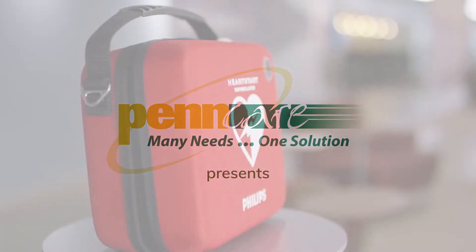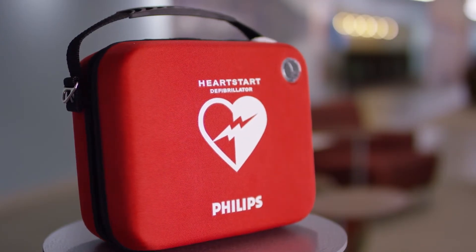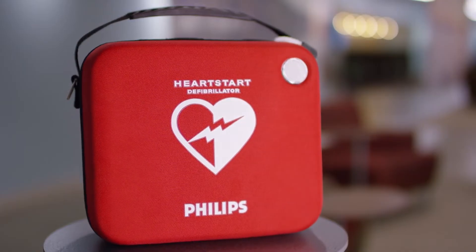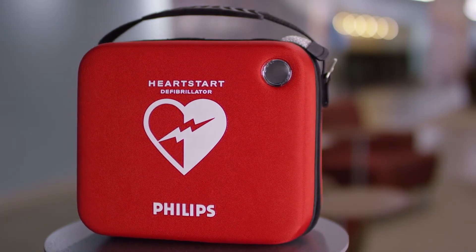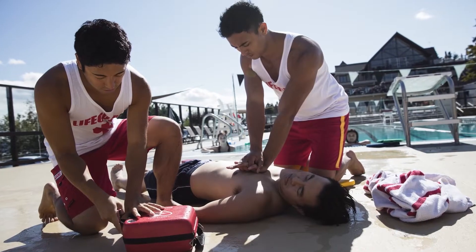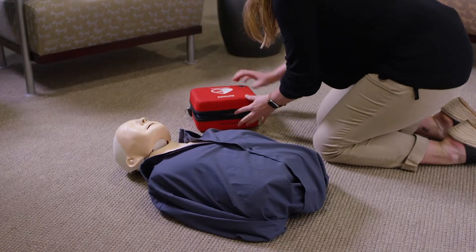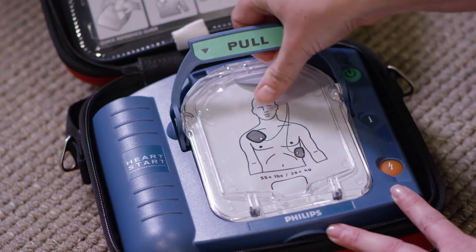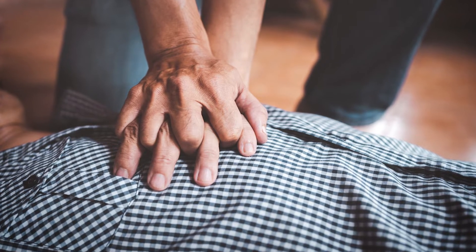PennCare presents the Philips HeartStart Home AED, an automated external defibrillator designed for home operation by an untrained or minimally trained user and available without a prescription. In this video, we'll be discussing how to operate the HeartStart Home AED, when to use it, and how to properly care for the unit in order to keep it ready for use.